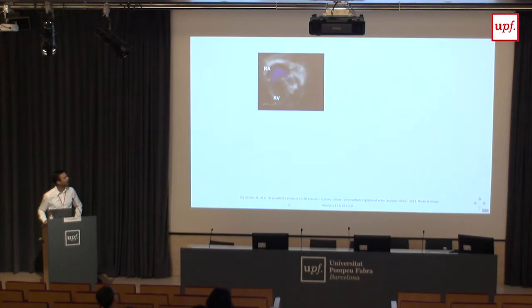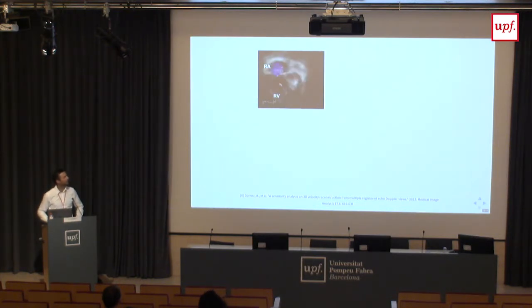So we did this, and then we tried to see what this can give us. So this is an example of visualization. In this case, we reconstructed flow just in the tunnel or in the channel that goes from the atrium to the ventricle. So in this case, it's the tricuspid valve because it's a specific case of diseased patients where the systemic ventricle is the right ventricle. And basically, just for visualization, we seeded some particles in the atrium and saw that they were going towards the ventricle. This is not of clinical significance, this particular example, but it's nice to see whether our results were somehow consistent. And then the flow is not reconstructed here, so it's meaningless what the particles are doing after the valve.